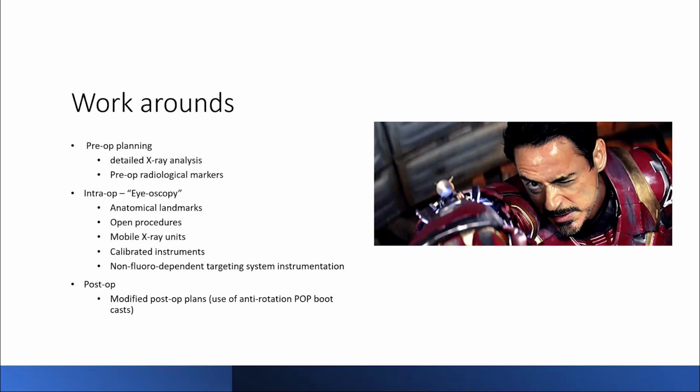The other thing is using calibrated instruments. So you can use guide wires that are calibrated from your pre-operative analysis. If you can determine that the length of the neck of the femur, for example, is 9 centimeters, and you have wires that are calibrated, you can then determine just how far to advance a K-wire into bone.